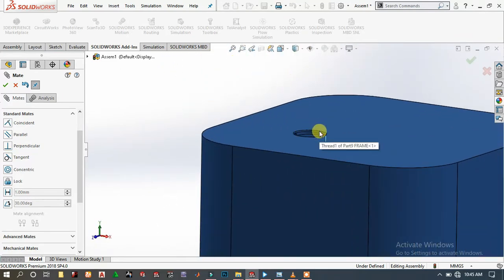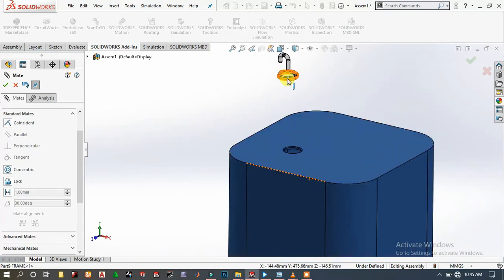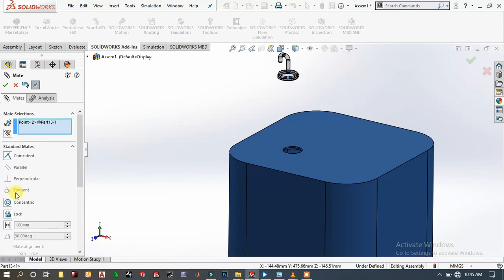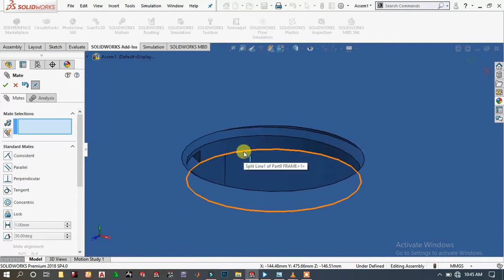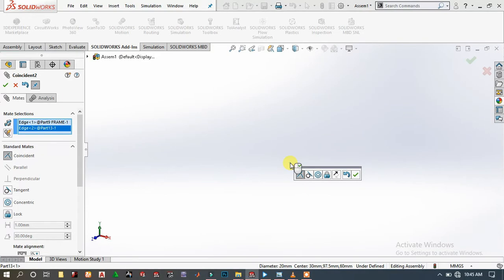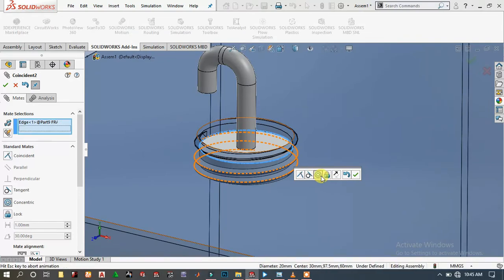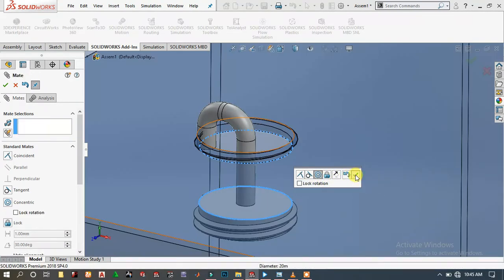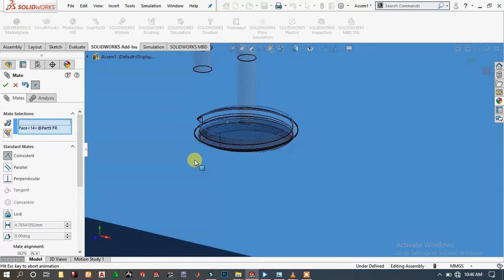Then here, drag it around there. It is an unnecessary constraint, so go to this mate selection and choose clear selection, then choose this circular edge and again this circular edge. Choose concentric mate and here click OK. Choose this face and this face, coincident mate. OK.